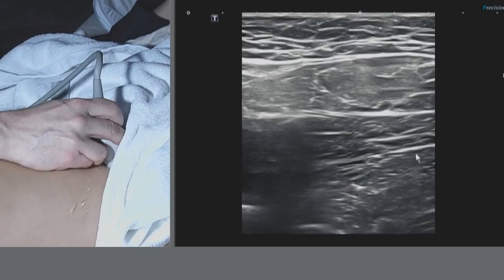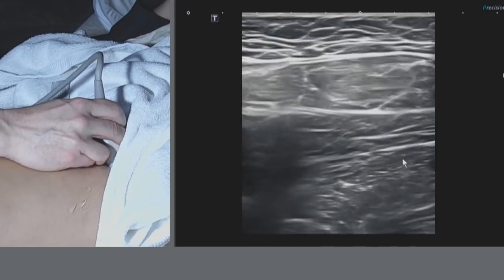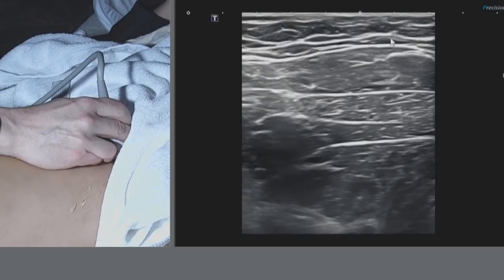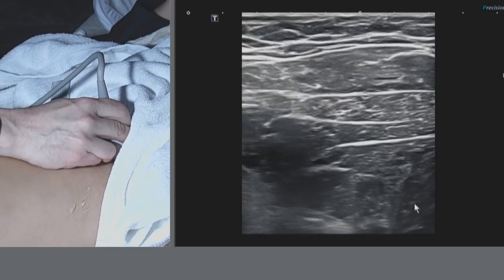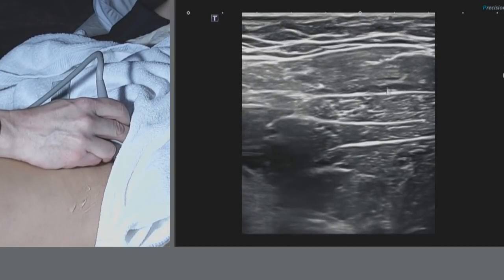In between that, you can see these fascial planes, and in these fascial planes are the anterior and posterior branches of the obturator nerve. Their fascicles will be coming through here. But you can see nicely this order of longus, brevis, magnus. The mnemonic some people use is Alabama, where AL, AB, AM, so it's longus, brevis, magnus.